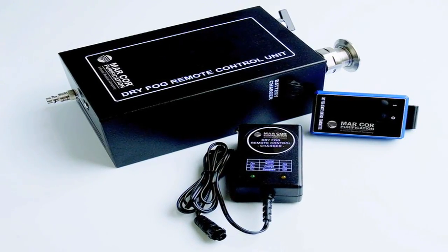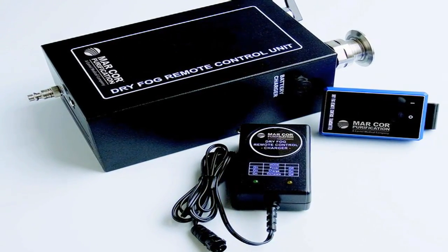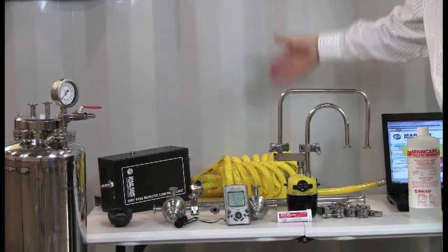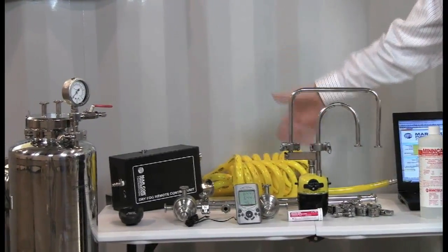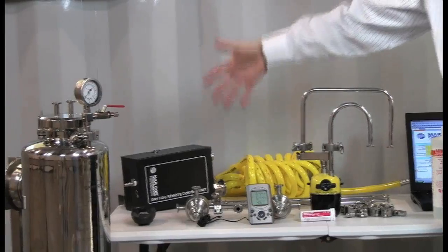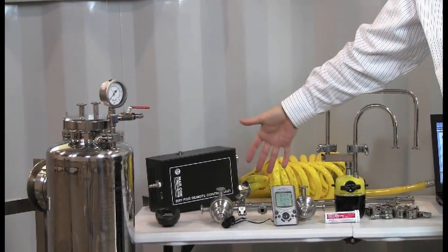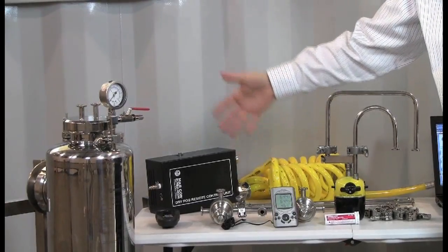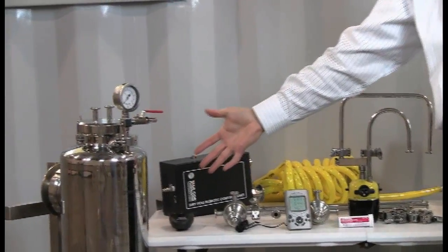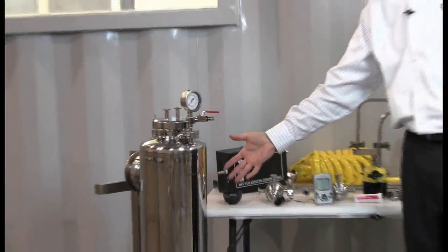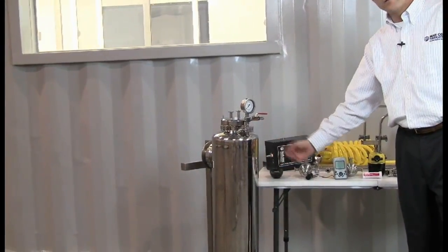Dry fog remote to turn the unit on and off when you're outside the clean room, compressed air connections, different connections and piping, regulator to regulate the compressed air to the tank as well as to the head, and the dry fog machine tank itself, which utilizes MinCare, water and compressed air.